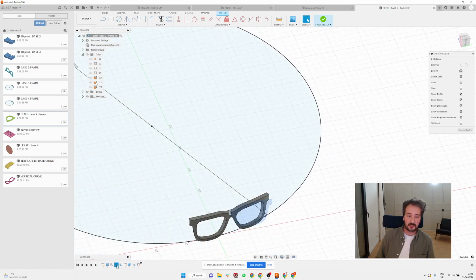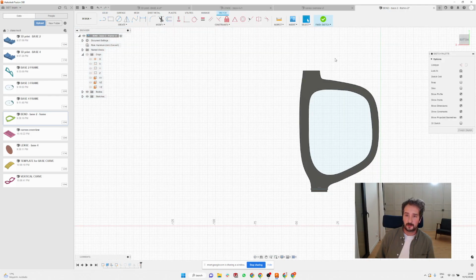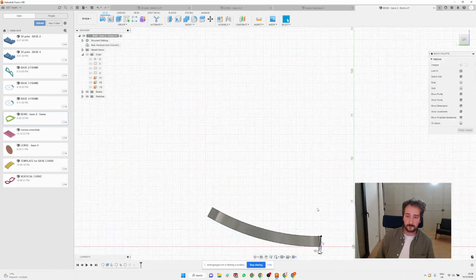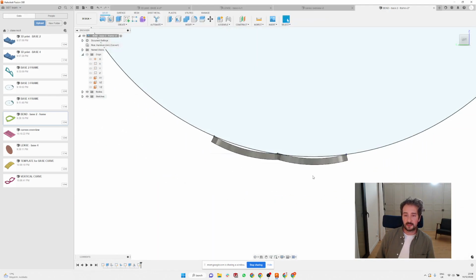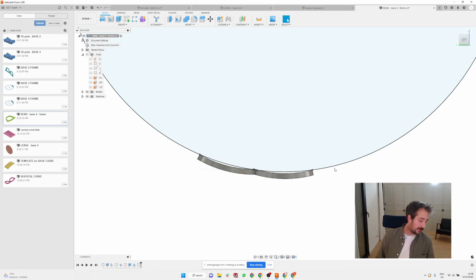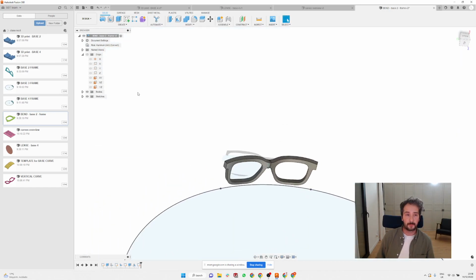And if you want to change this to be even flatter, you can just go back to your original sketch for that little angle. That's the wrong one, it's this one, and that was 10 degrees. And I think if I change it to, let's say, 7.5, that is supposed to be an almost perfect base 2 curve on the frame. I'm just going to hide this.